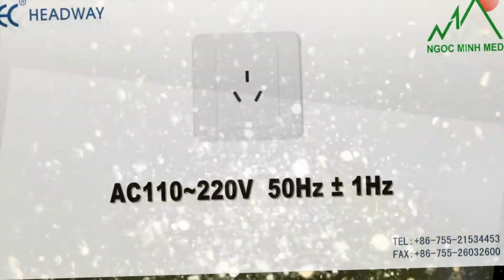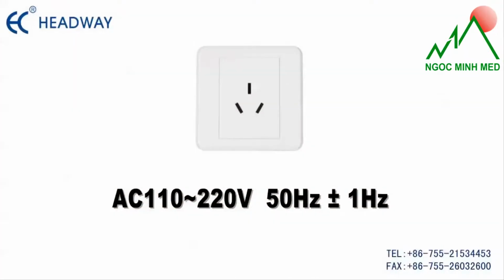Frequency 50 Hz plus or minus 1 Hz. Power should be more than 250 volt-ampere.